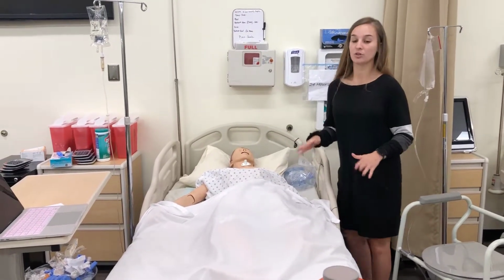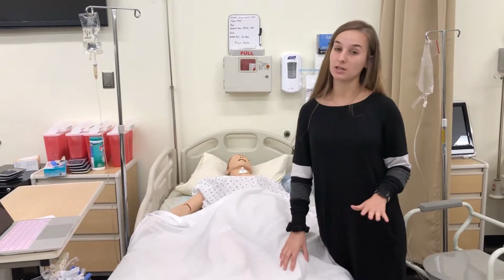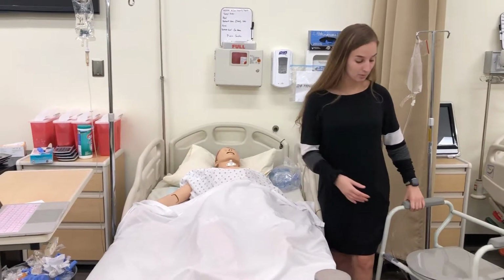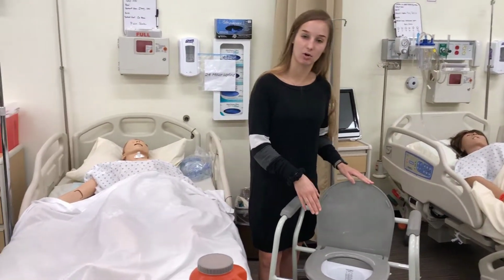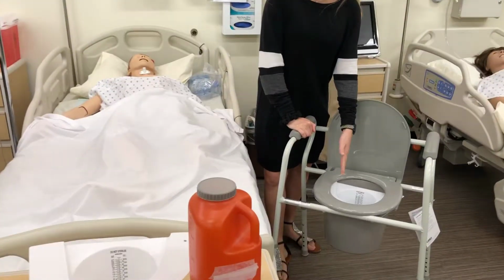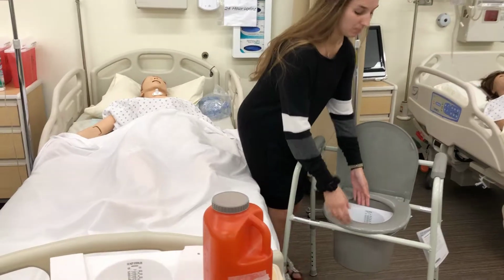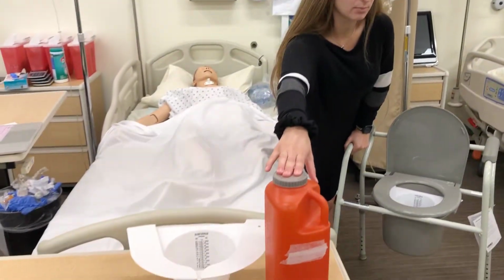Okay. So basically, if a patient was mobile, it could be a clean procedure because I could easily get my patient up from the bed, bring them to the bedside commode, and when I set them on here, there would be a urine hat for them to urinate into, and I could easily, once I put them back in the bed, pick this up and discard it into the basin.